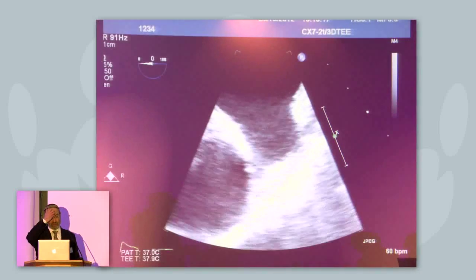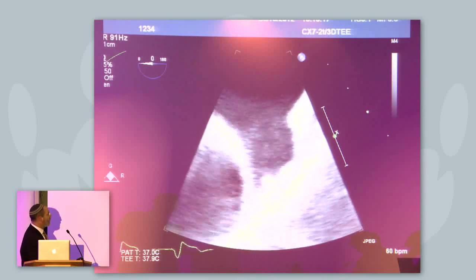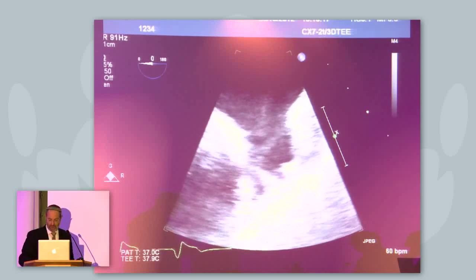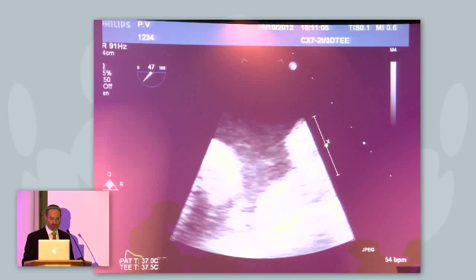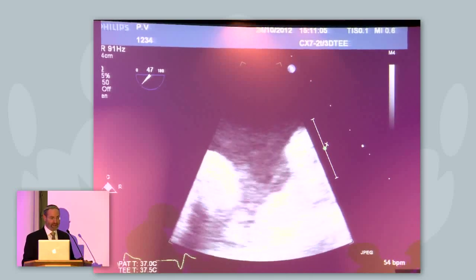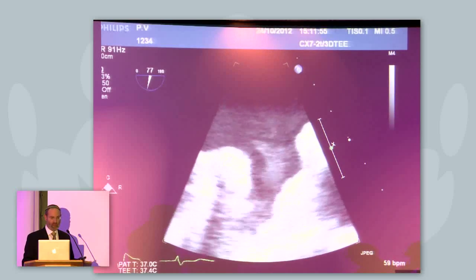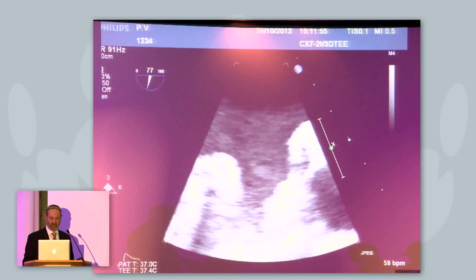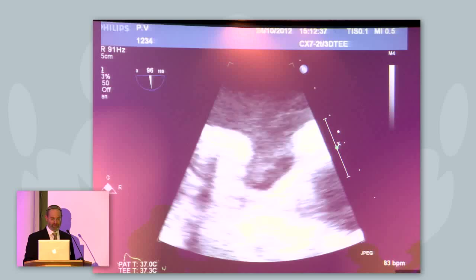Here we're going to start off with some TE scanning, and here you can see, starting off in the 0 view, this is going to be the long axis, and we can see there's lots of smoke. Get some sort of concept as to what's going on. We're going across to about the 45 view. We can now start to see a neck and see some more body. Distinction between the axes of those, going across more to the 70, 75 view, same sort of thing, lots of swirling. Then we're going to go across to the 90 view.